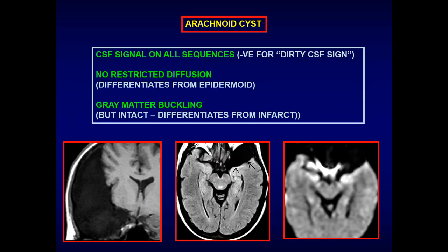On CT, this appears as an arachnoid cyst. On MRI, a large CSF-intensity lesion on all sequences within the sylvian convexity — the typical location. In another slice it is situated within the middle cranial fossa. To differentiate from epidermoid, a diffusion sequence shows absolutely no restricted diffusion — which, if this were epidermoid, would show light-bulb-like restricted diffusion.